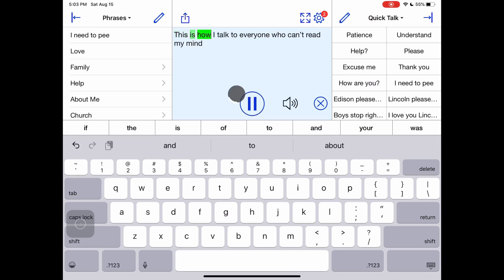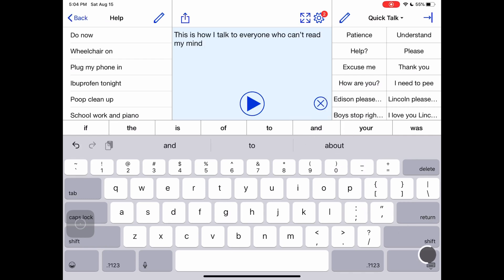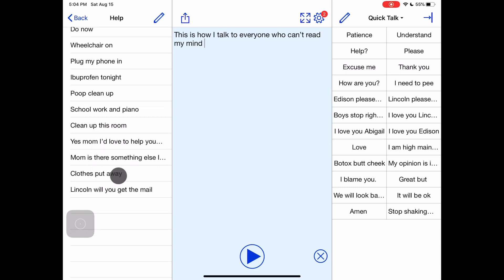This is how I talk to everyone who can't read my mind. It also stores phrases for quick access. Most of mine are aimed at my kids.